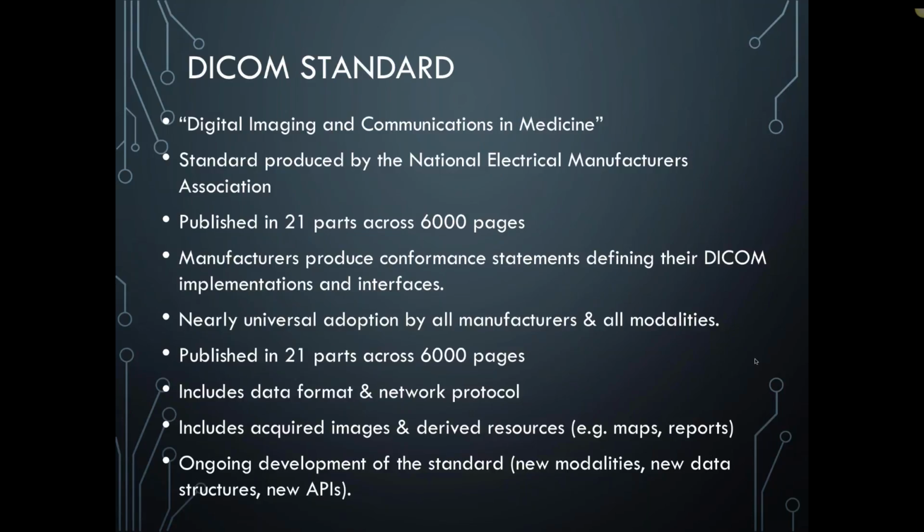It's so complicated that vendors are required to produce a conformance statement describing how they actually comply with this complicated protocol. And you can read through those conformance statements and really get an understanding of what portions of the overall DICOM standard that a particular device implements.